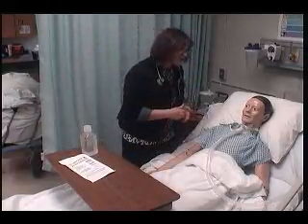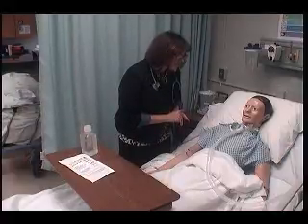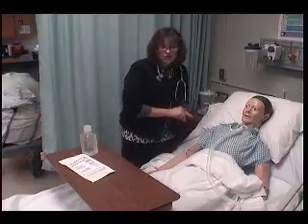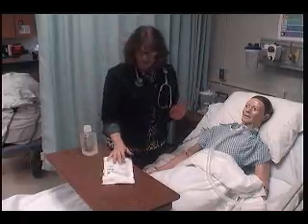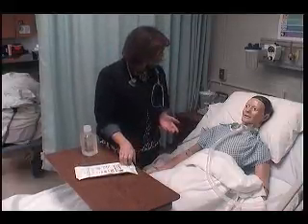I try to get them to cough: 'Sir, can you go ahead and try to cough some of those secretions up for me?' He's unable to cough up his secretions. 'Would you like me to go ahead and suction you?' He shakes his head yes. So I tell him what I'm going to do. I've reviewed my order, I've assessed the need, and now I'm going to explain the procedure to the patient.